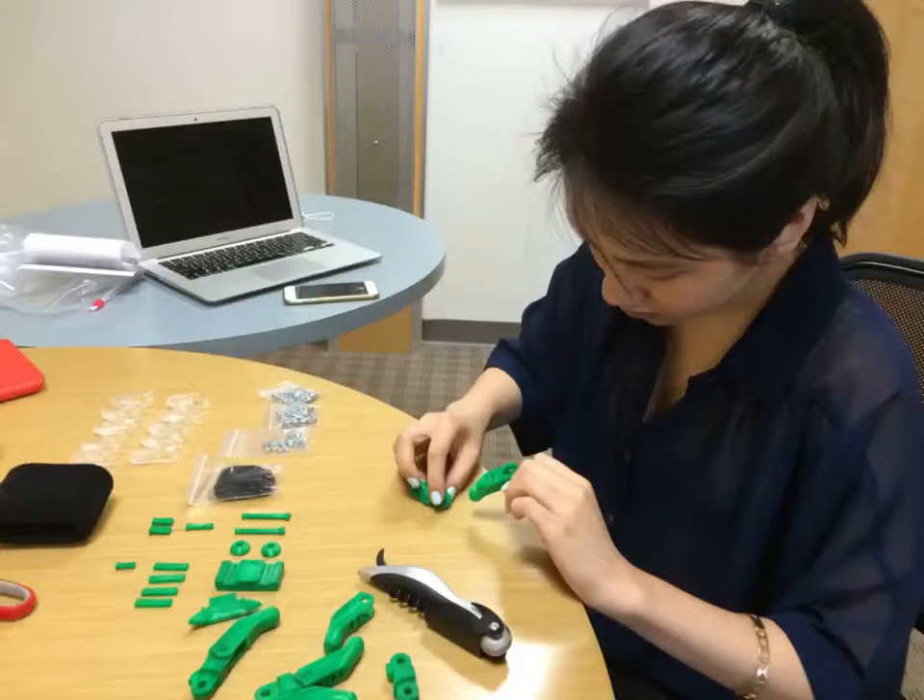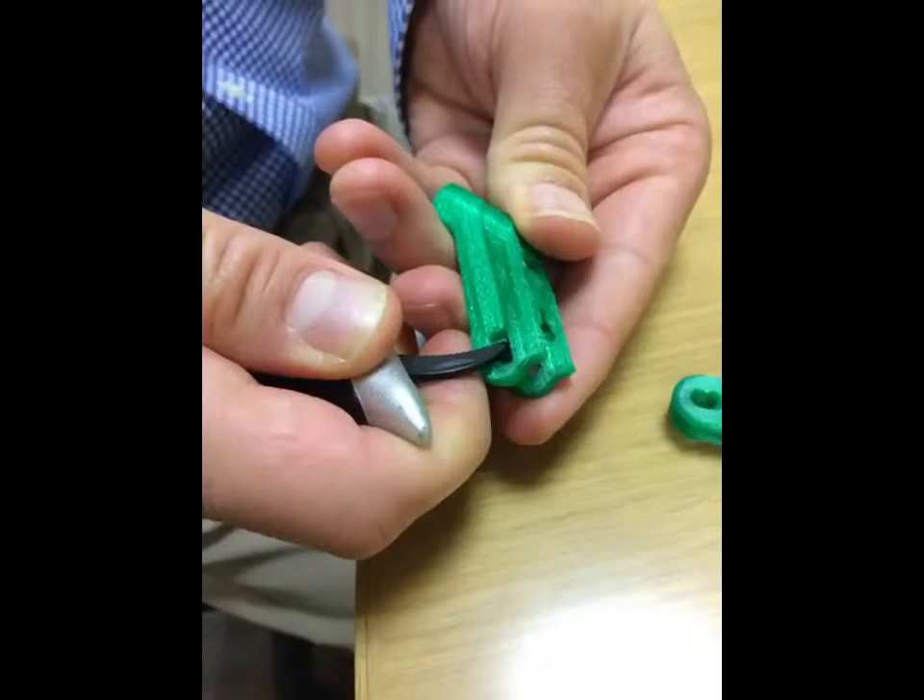The first step was relatively easy, which was to put together the fingers with the snap pins. We actually had to use a Swiss Army knife to scrape away some of the unclean parts so that we could put the snap pins through the hole.